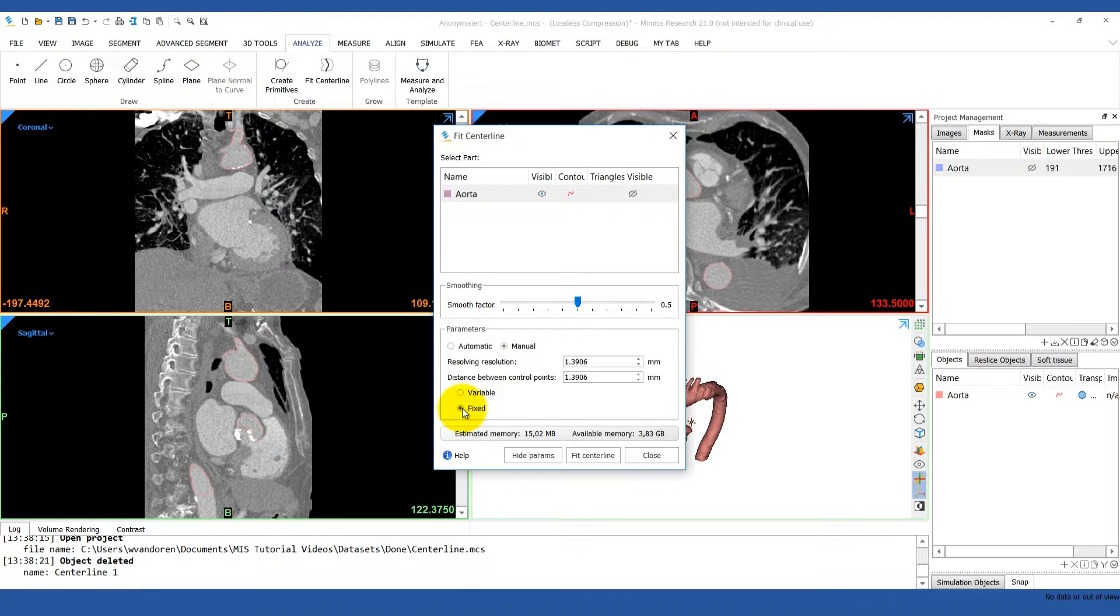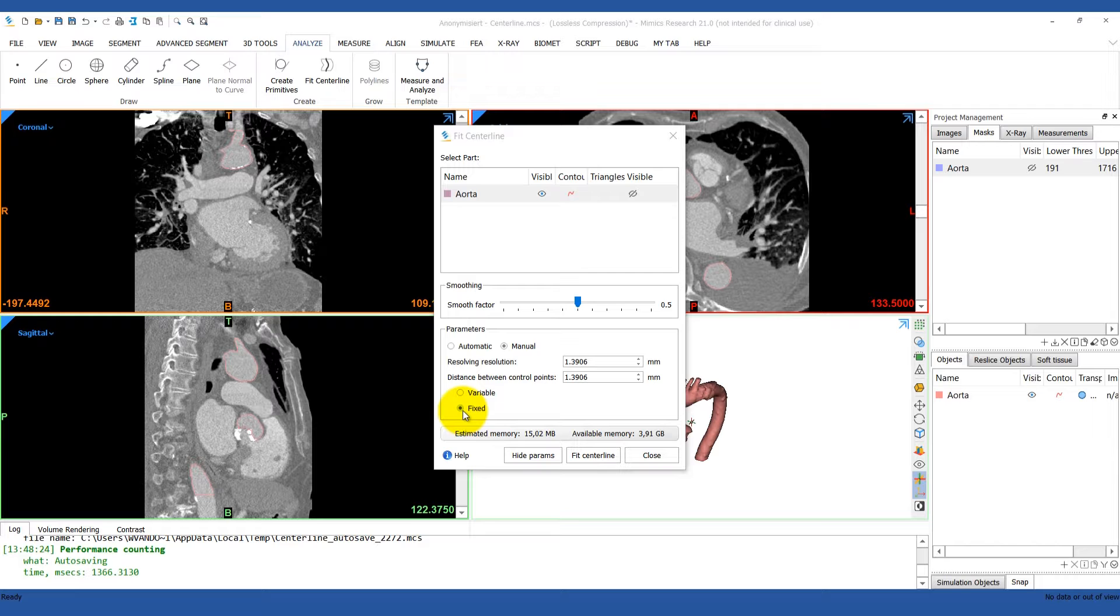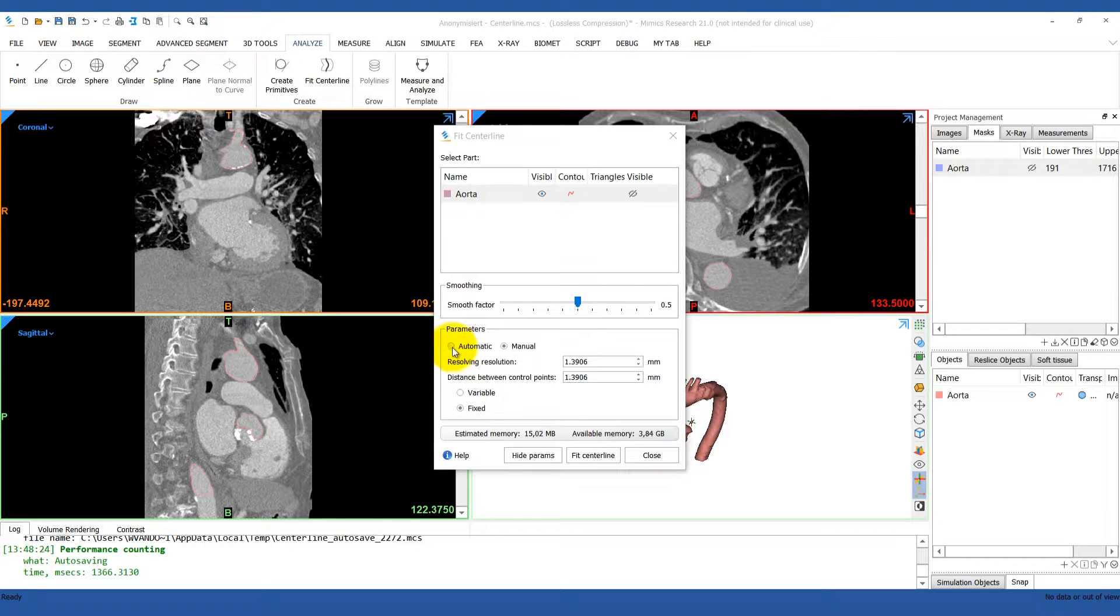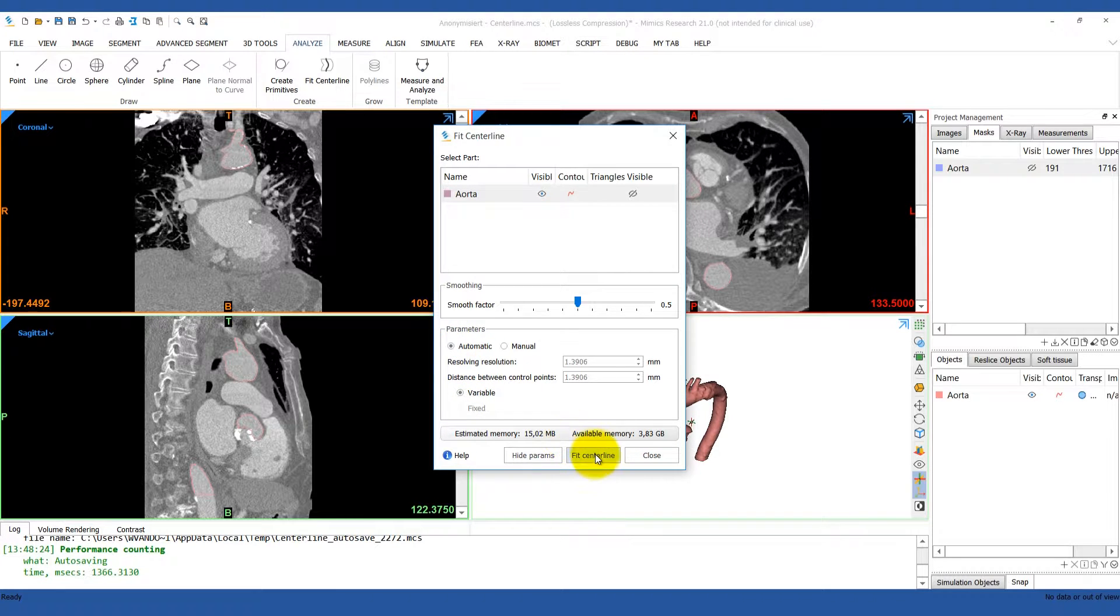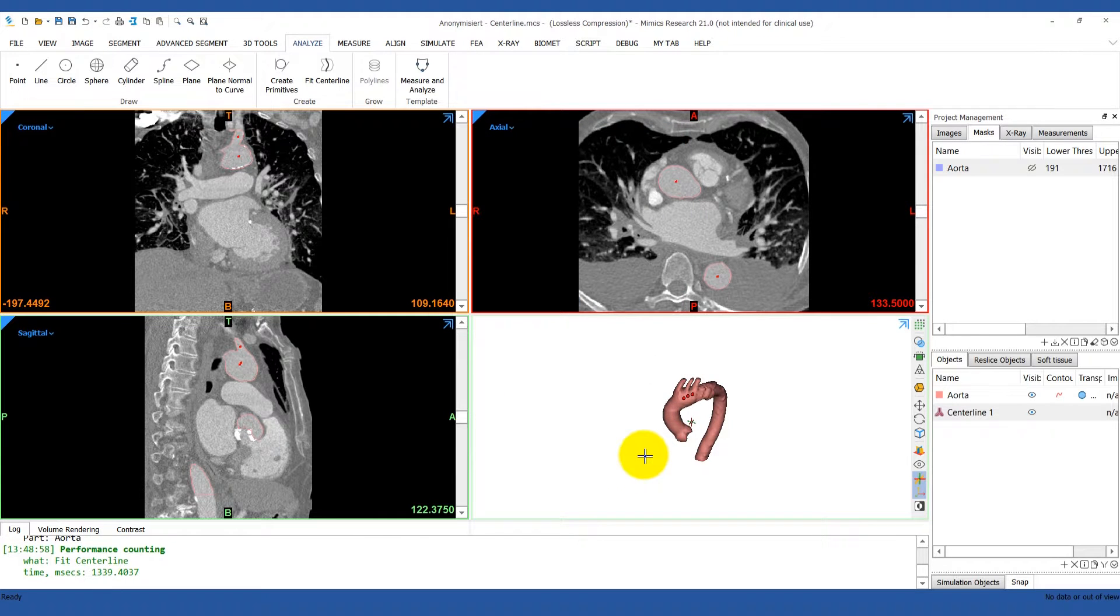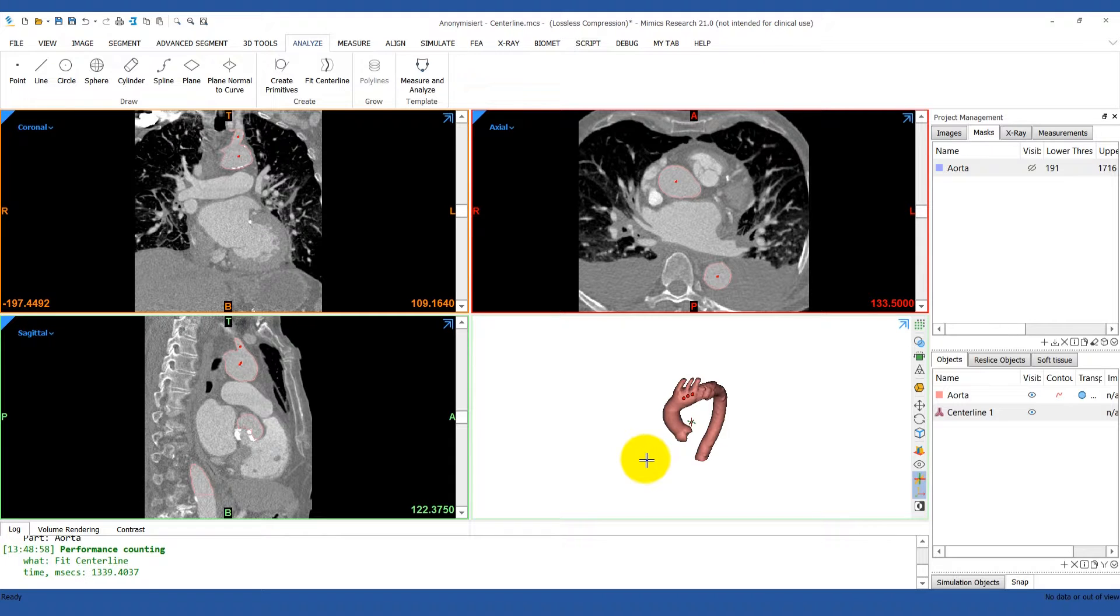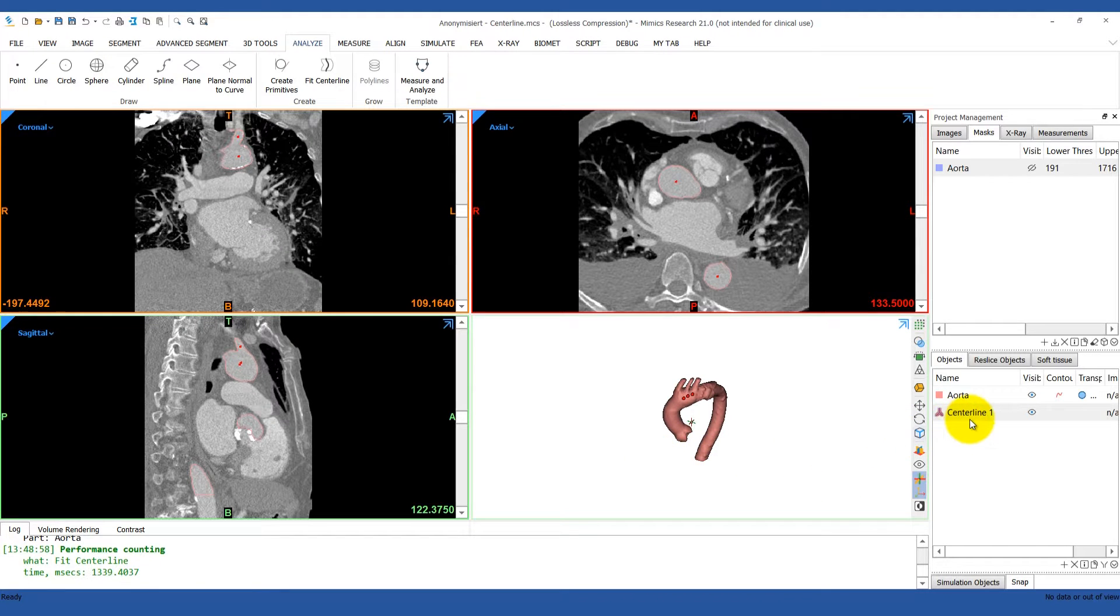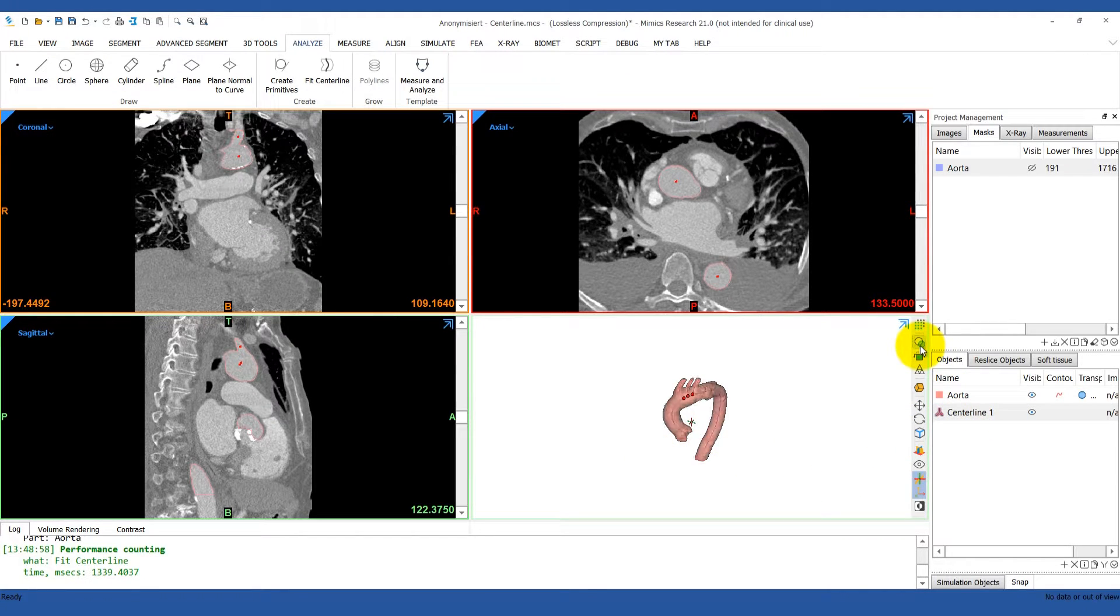Once the parameters are set, click Fit Centerline. It will calculate and you can close the tool. Now, if you go under your Analysis Objects tab, you'll see the centerline listed, and to visualize it, you can toggle the transparency of the 3D model.